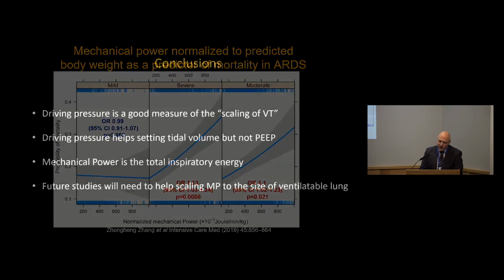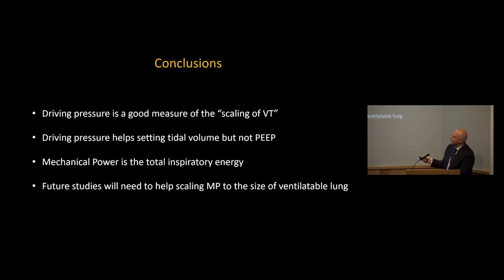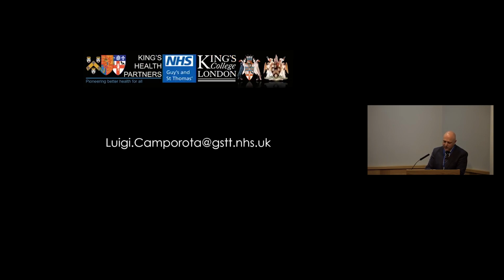So this is my conclusion: driving pressure is a good measure for scaling tidal volume. It helps with tidal volume setting, but not with PEEP. So I wouldn't recommend using the PEEP level that gives you the smallest driving pressure. Mechanical power is the total energy, but actually we don't know how to use it and what the threshold is, either total or scaled mechanical power. So this was a quick run through of driving pressure and mechanical power.